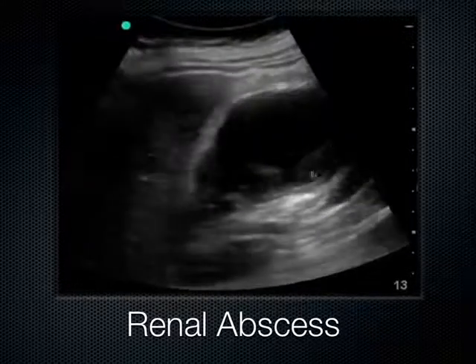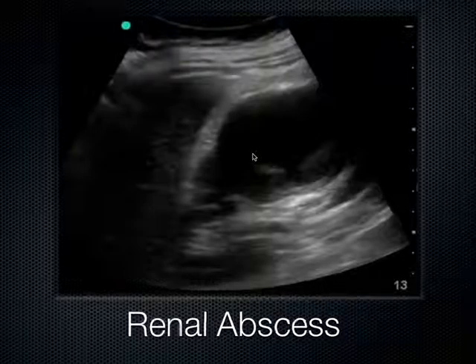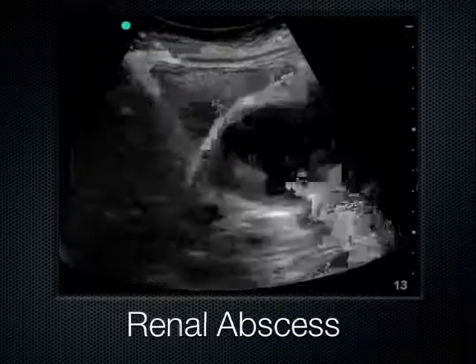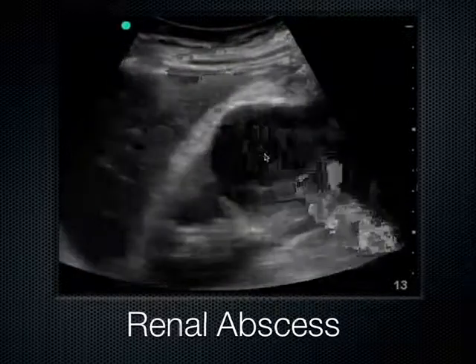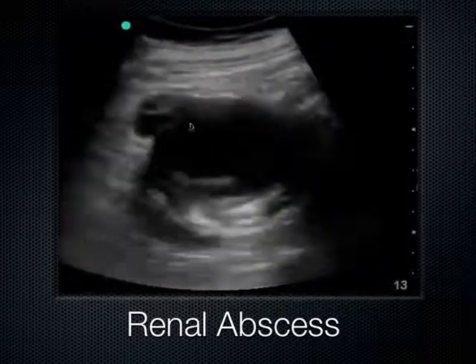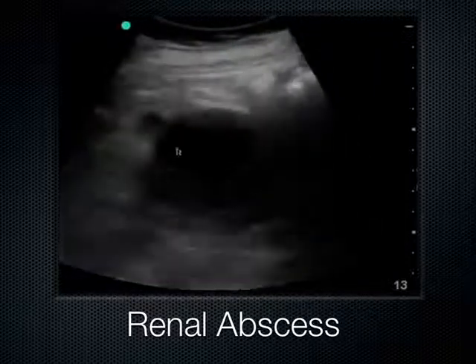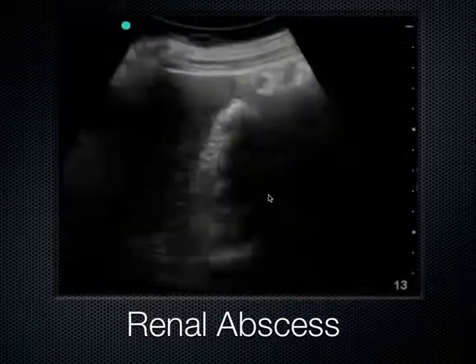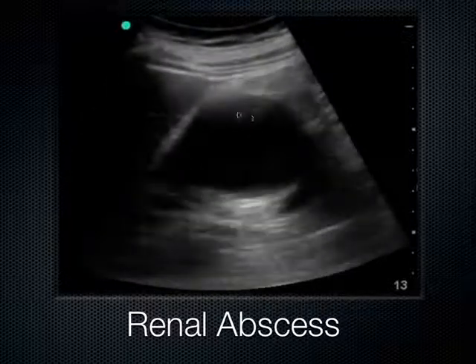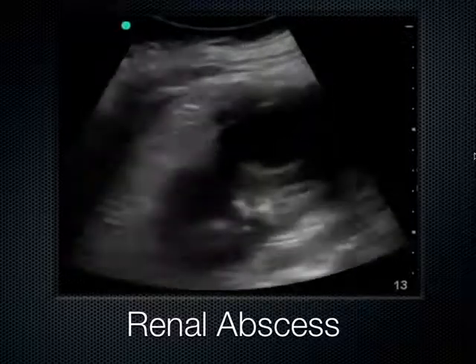Turning up the gain — here is the liver, so this must be the right kidney. In the short axis we can see a hypoechoic area within the lower renal pole. This is what a renal abscess looks like on ultrasound.